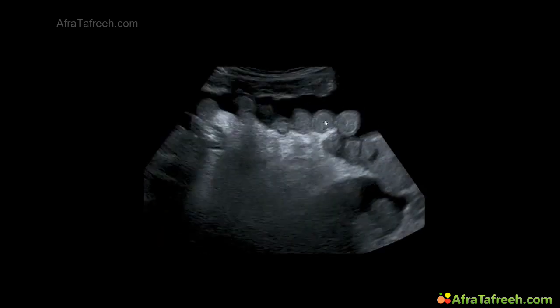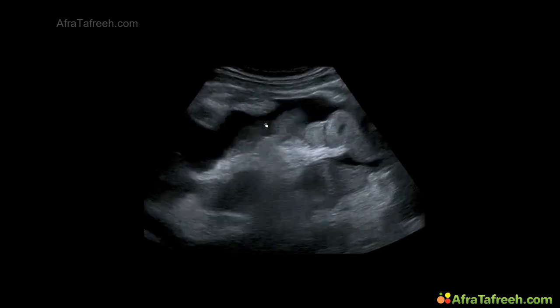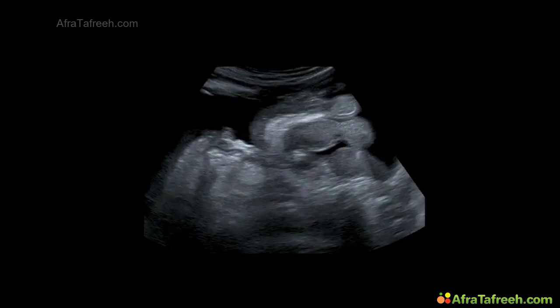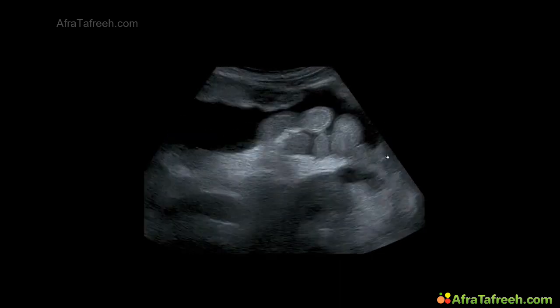We see intestine in between all these huge amounts of anechoic liquid, indicating ascites in the whole abdomen.